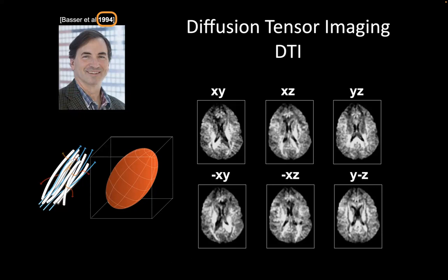This is DTI. So in theory, if you do the math, you only need 6 images. In practice, you need at least 12 because this is noisy, and a good rule of thumb is twice the amount of measurements than unknowns. And now, because things go so fast, by default most MRI just do it with 30 directions or so. Okay, so this is DTI.